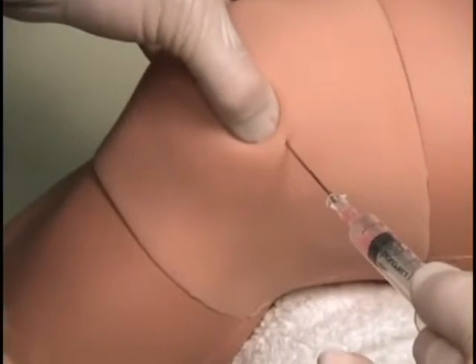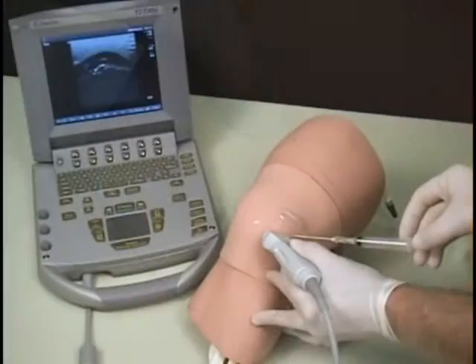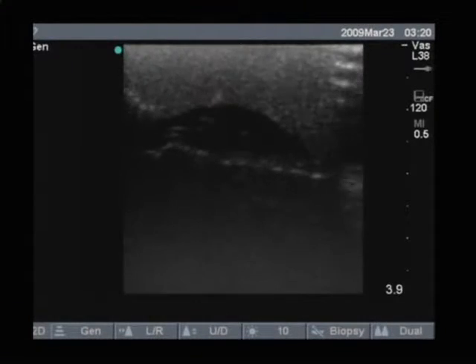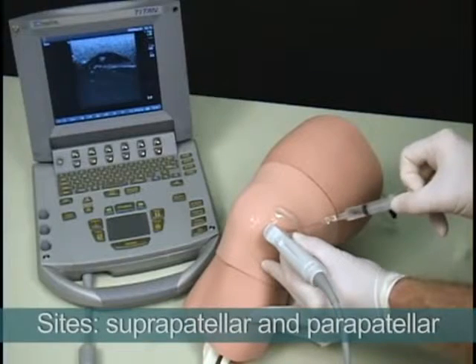The tissue is durable for repeated use and it is easily replaced. Simulated synovial fluid can be removed from a joint cavity using either the medial or lateral approach. The model's insertion sites include suprapatellar and parapatellar.